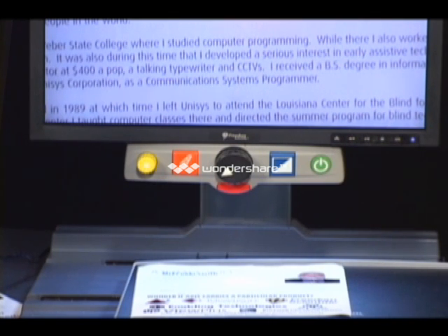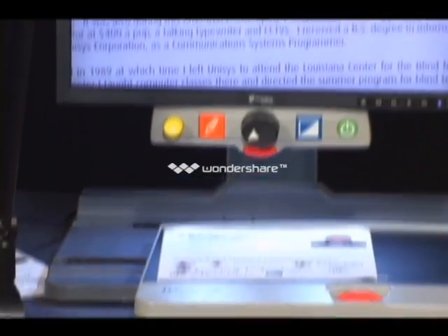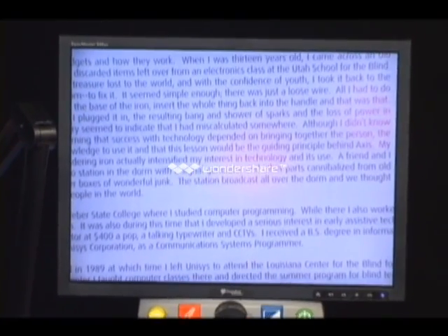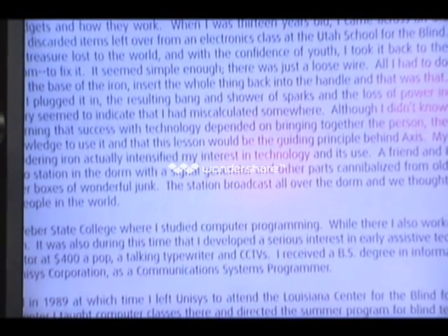There's a little button below the size control which you can push, and it puts a red dot down on the page. I'm not sure if you can see this or not. If you're up there. Yeah. The red dot shines on the page exactly where the camera is looking. That's called a locator dot.